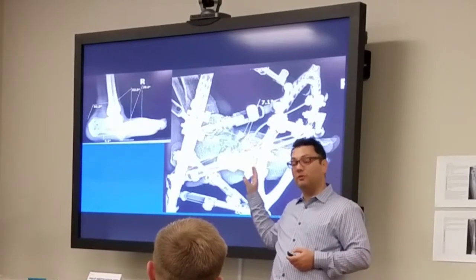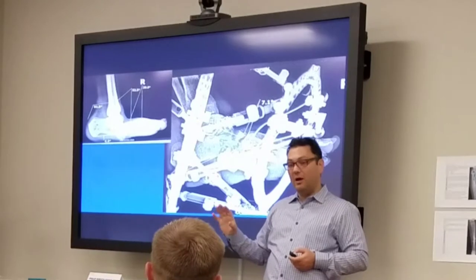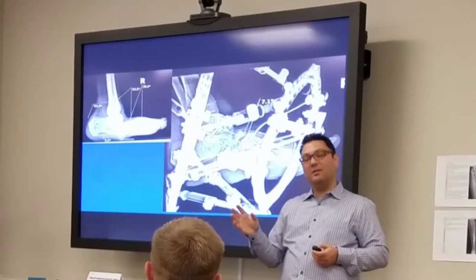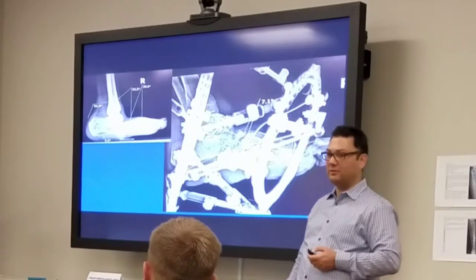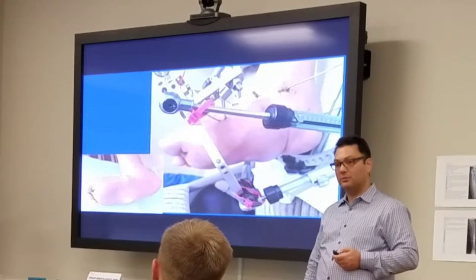We're talking in these Charcot foot, very different than flat foot. Flexible flat foot and that kind of stuff is a whole different story. But we're talking about equinus to rectus, varus to rectus. That stuff really doesn't need much of an osteotomy. So you just correct into a calc axial until you see what you like?